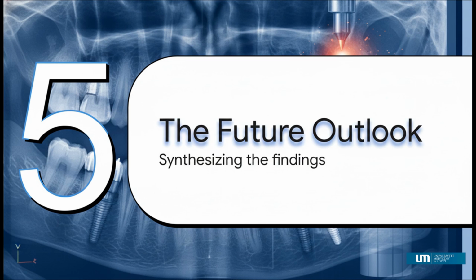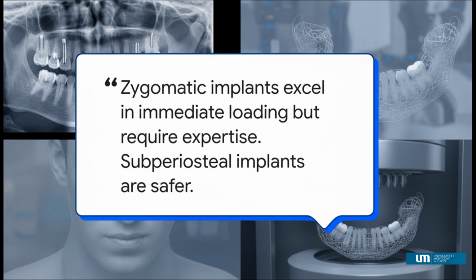Okay, let's wrap this up by synthesizing the study's main thesis and thinking about the future directions that this research points toward. This quote from the study's conclusion really captures the clinical reality perfectly. Zygomatic implants are great for immediate functional loading and have shorter procedure times, but they demand advanced surgical expertise. In contrast, subperiosteal implants provide a safer, more customizable option, especially when you're dealing with anatomically complex cases.